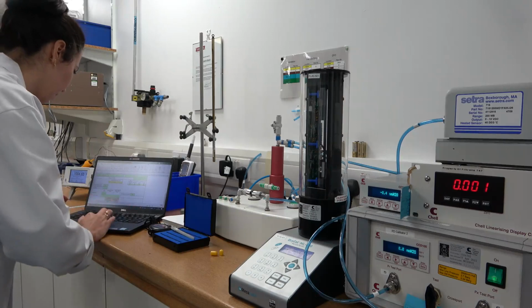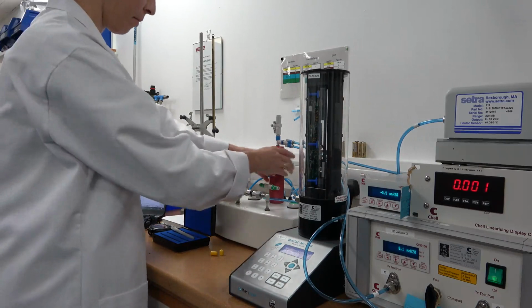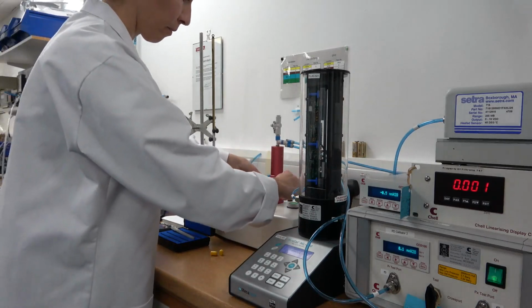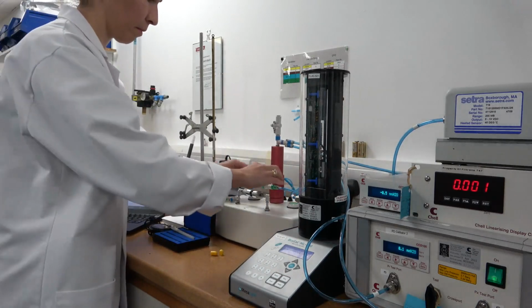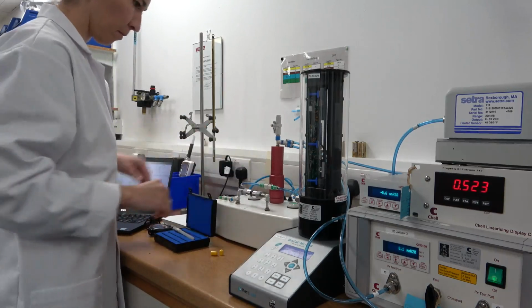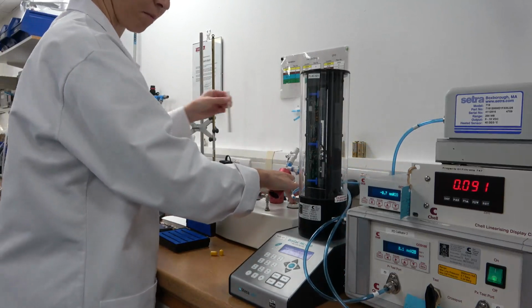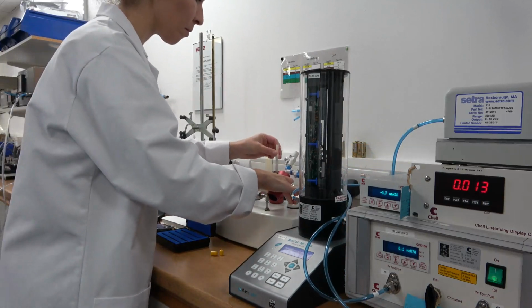the outlet length. The ultimate accuracy of any measurements is directly affected by the accuracy of the calibration standard used to make the instrument calibration. That's why special requirements for handling, storage and maintenance of the standards are essential. Depending on the standards, there are slightly different requirements.